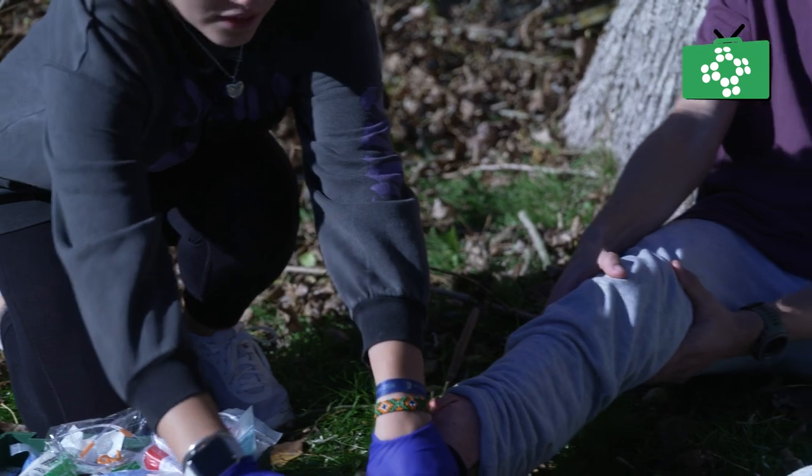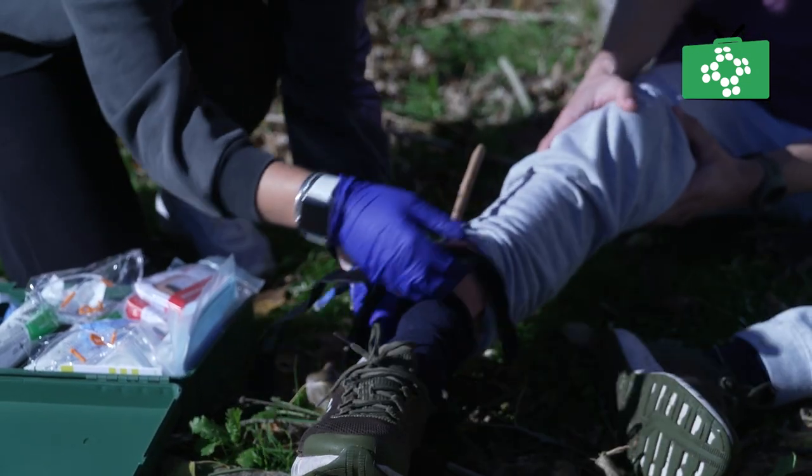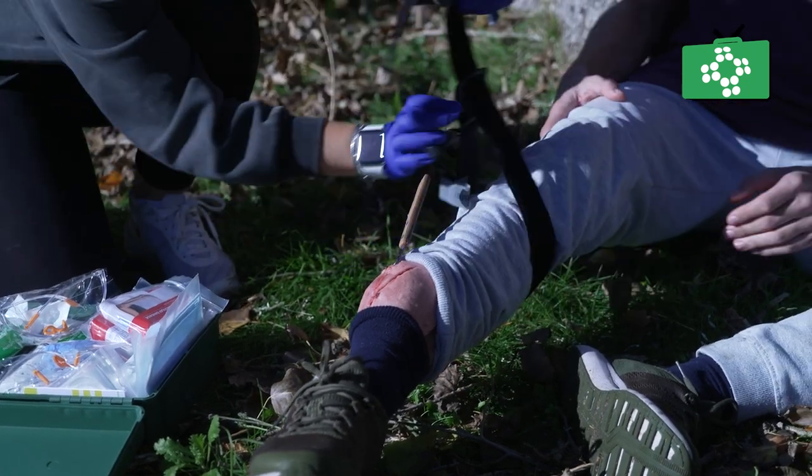To use the tourniquet, sit the patient down and explain to them what you are doing. Activate the emergency medical services if you have not already done so. Open the packet, take out the tourniquet, place it around the limb and tighten it using the windlass tightly until the bleeding stops.